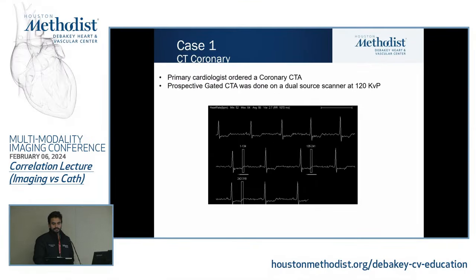You could have done either, and I don't think there was a wrong answer here. At the point of image acquisition, what's the tech more comfortable with? When you can see a T wave, or you know that you're getting a T wave, techs are more comfortable, at least here, with end-systolic imaging, and I don't think we have a real drop in quality because of that. So I think we could have gone either way in a patient like this, but in faster heart rates, doing end-systolic imaging definitely gets you better bang for your buck.